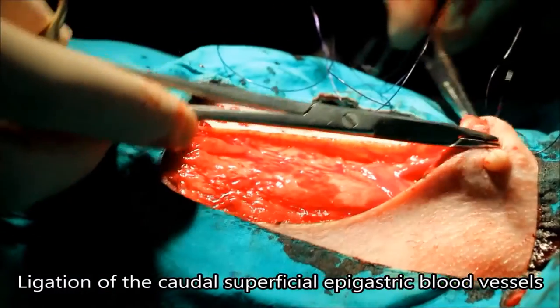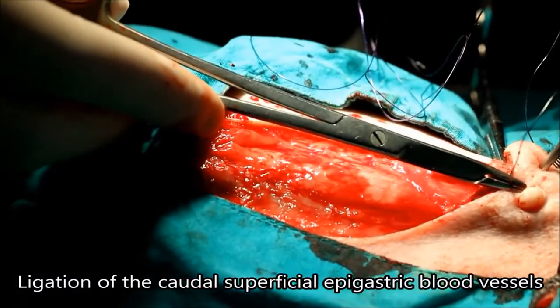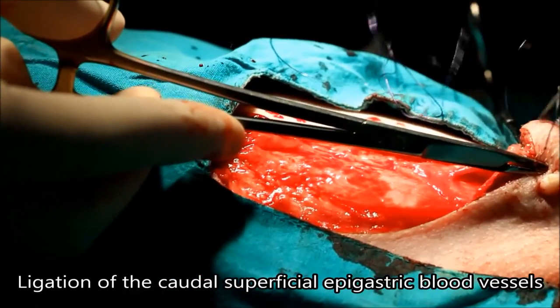After identifying and isolating the caudal superficial epigastric vessels, the vet ligates the vessels to prevent the dog from bleeding out.